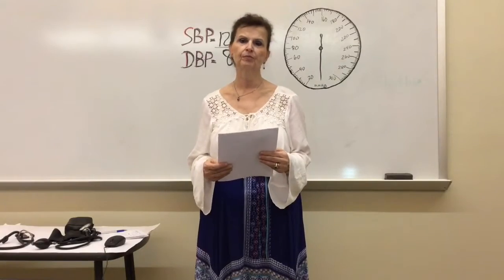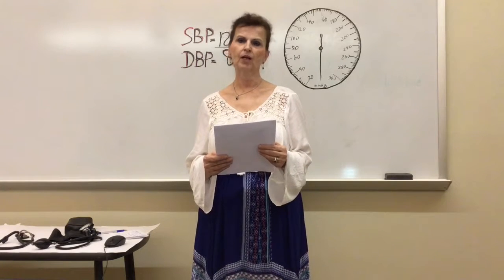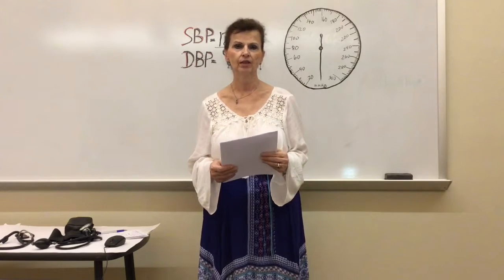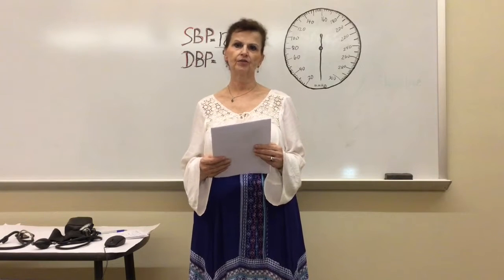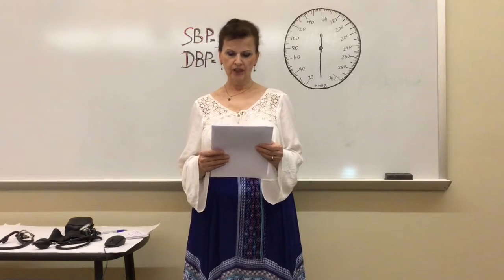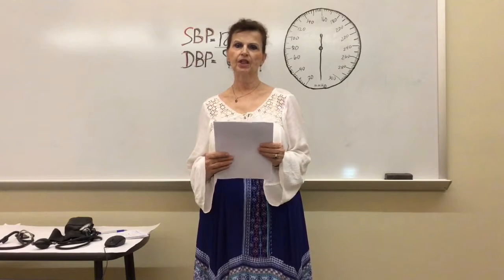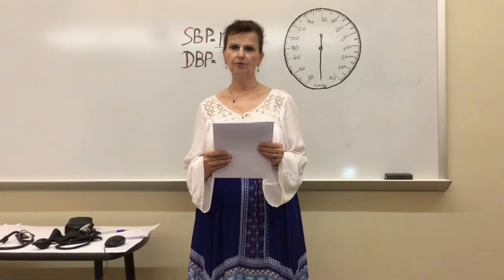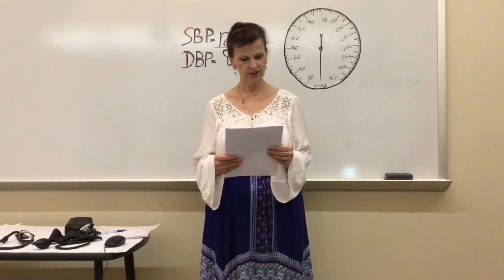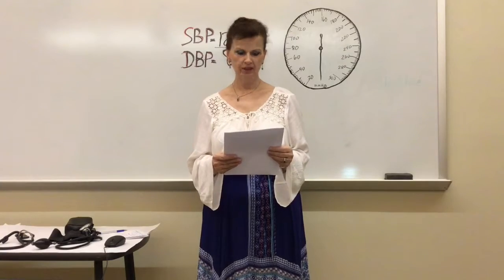The objectives for the presentation are: 1, after watching the presentation, the learner will know why hypertension is known as the silent killer and what the risk factors are for hypertension. 2, the learner will know and demonstrate how to take a blood pressure reading. 3, the learner will know how to teach their peer how to take a blood pressure reading. 4, the learner will know how to assess the blood pressure reading.